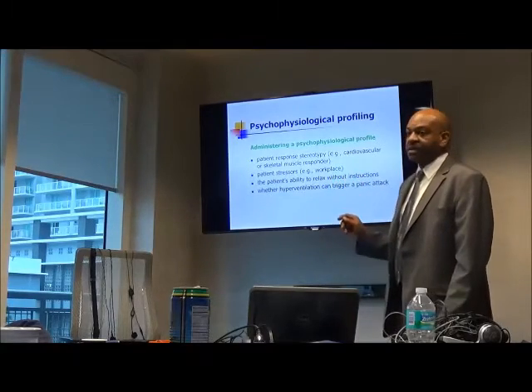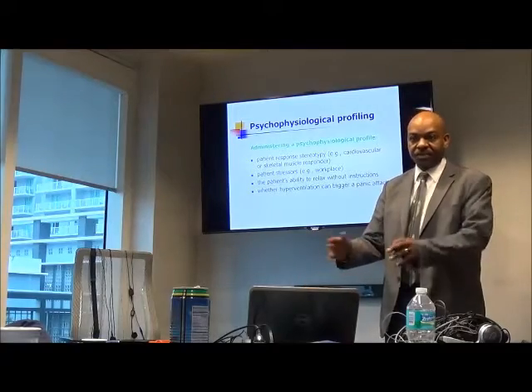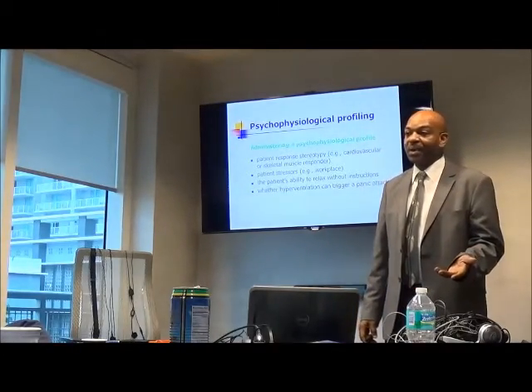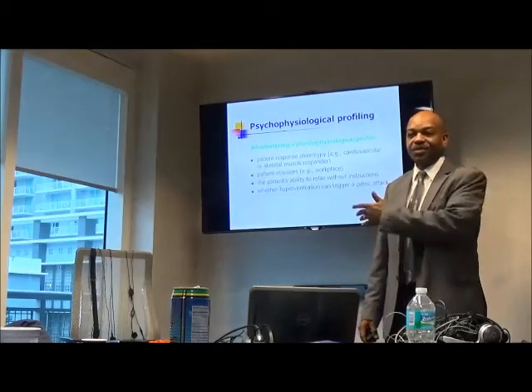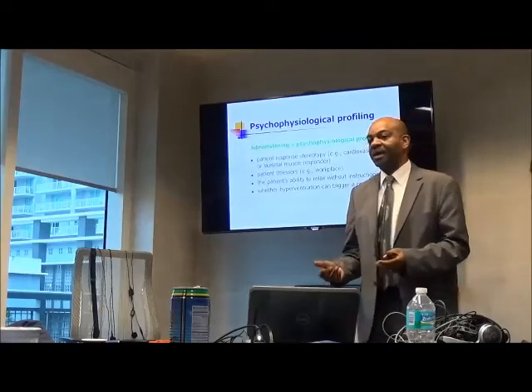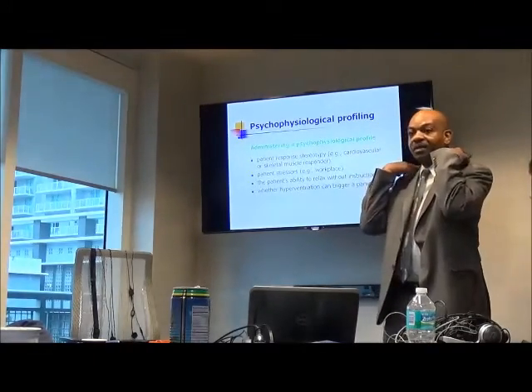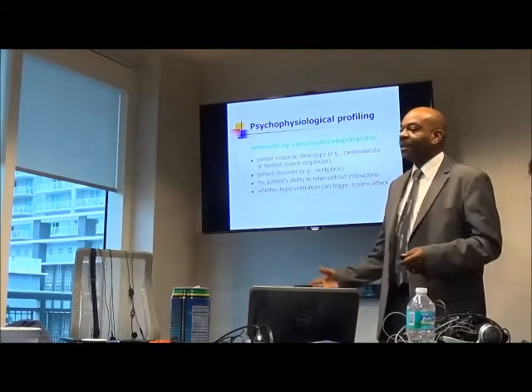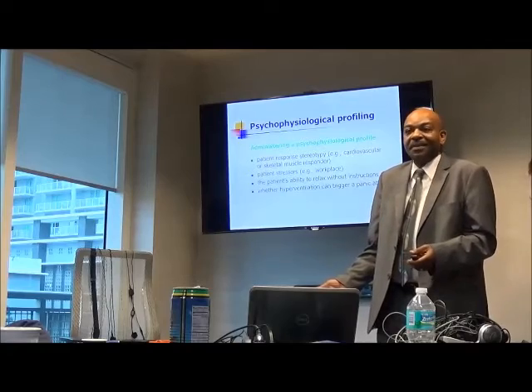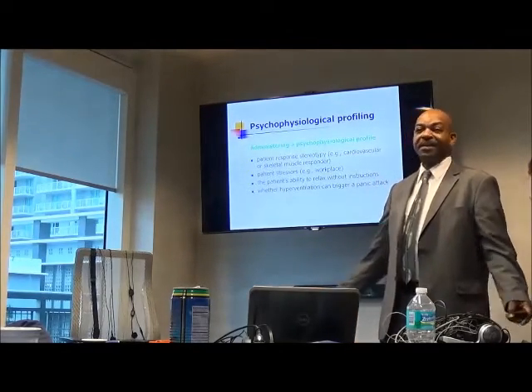You're also looking to see, are they able to relax without you guiding them through relaxation, just from the beginning? Because sometimes a person is able to relax okay, but it's just during those stresses they have a big reaction. So for instance, you might have someone who has, let's say, muscle pain in their upper back. They may have a job that during the work they're tensing a lot. But then when they come home and they're sitting on the couch watching TV, they're very relaxed.